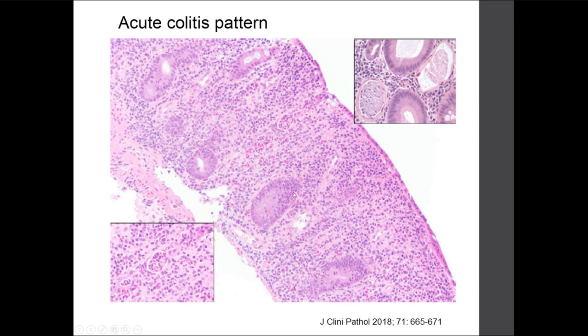So I think the key to this is to think of drugs, go back to the history, check on this in these particular drugs, in particular if you see increased apoptosis.